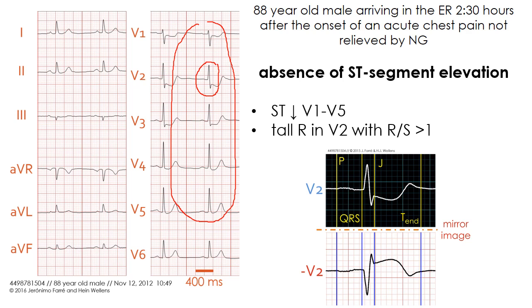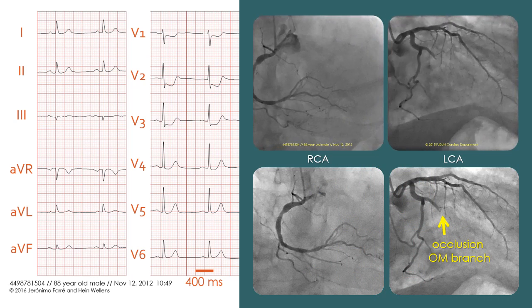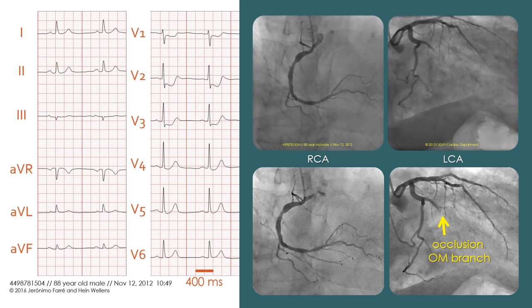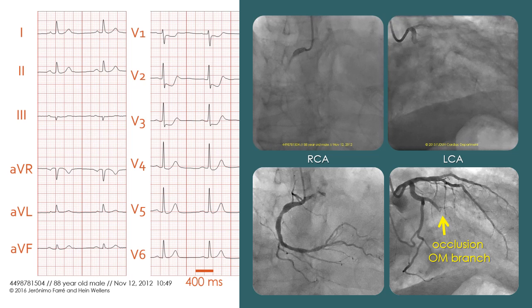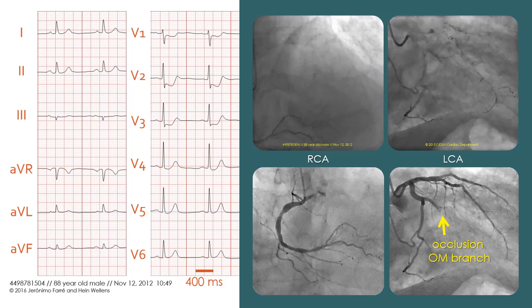Plus a tall and broad R-wave in lead V2 with an R-to-S ratio greater than one. This R-wave and the ST-segment depression in lead V2 are the mirror image of a wide and deep Q-wave and an ST-segment elevation in an opposite posterior lead. The patient was subjected to an urgent coronary angiography that demonstrated a right coronary artery system without severe stenosis and total occlusion of the obtuse marginal branch of the left circumflex coronary artery.